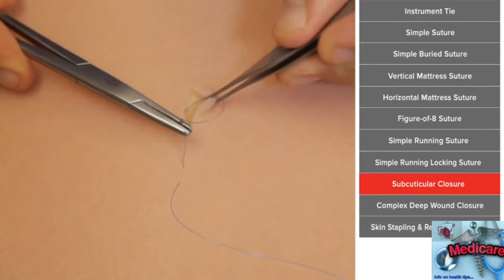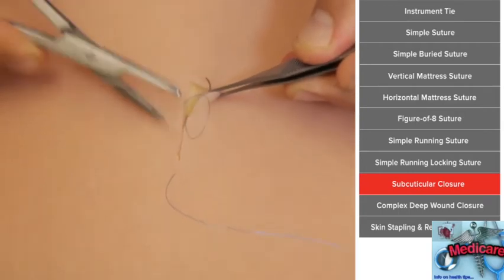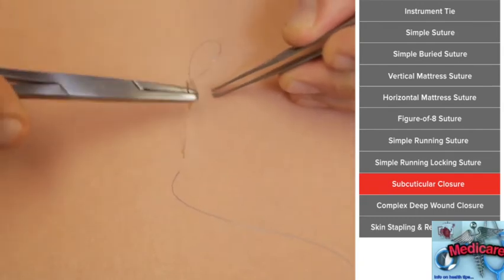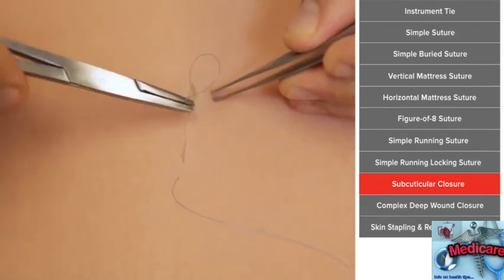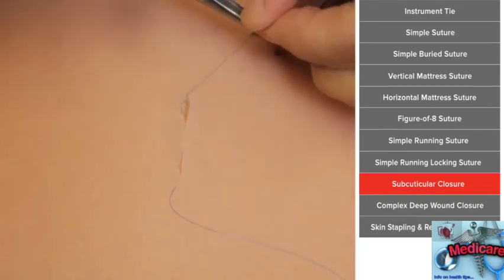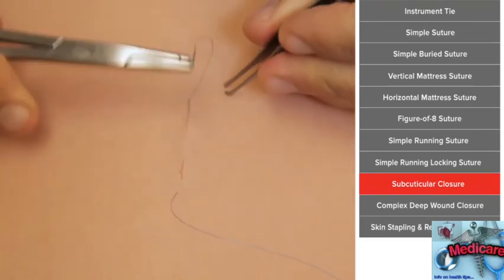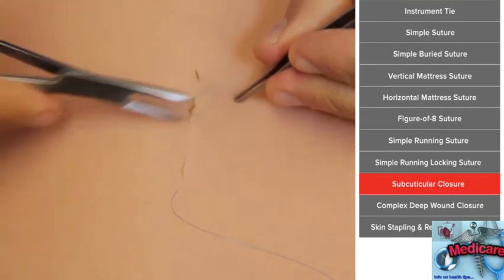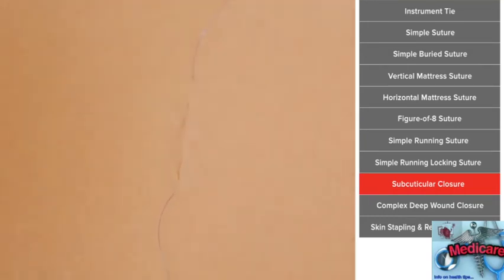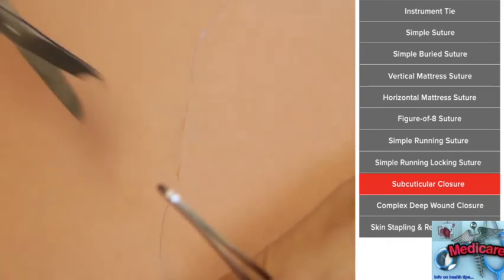But what you can find over time is that it really doesn't matter how much you advance as long as you're doing the same each time. I will tell you, if you're hoping to pull this stitch out later, like maybe after a week, then you'd want to advance more each time. If you know it's a permanent suture that's going to stay in there, like something absorbable maybe, where you're not going to have to remove it, then you want to almost go back to the last stitch each time. So there are different variants, but the key is do the same thing each time.